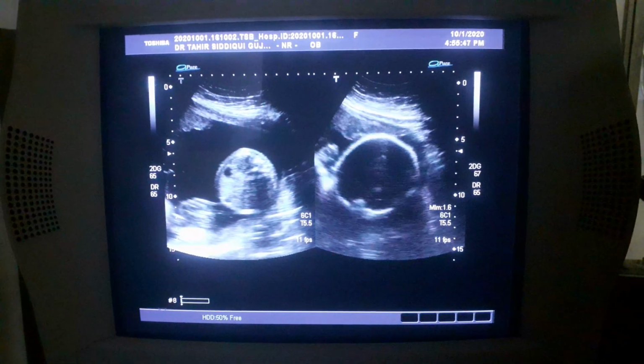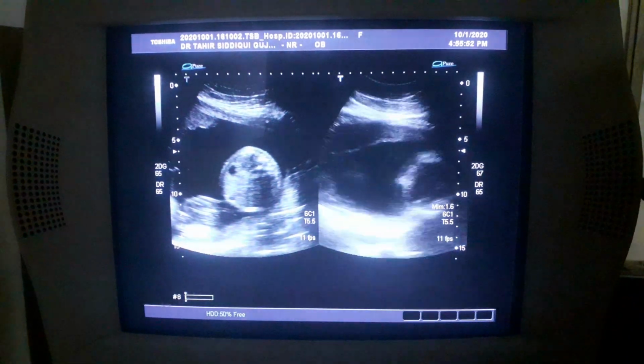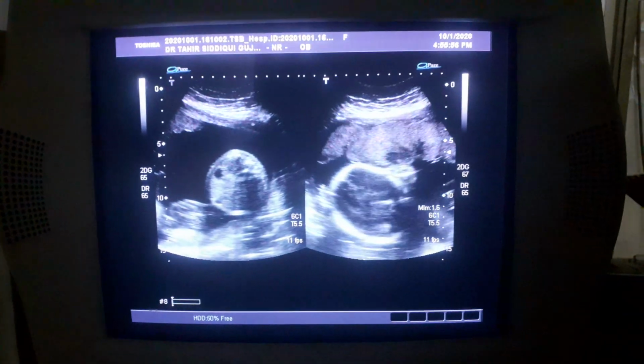I'm trying to get a better view to get the biparietal diameter. So okay, we can take any one. It will not matter.